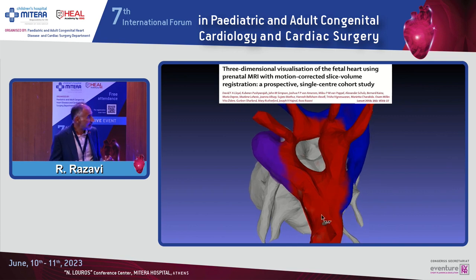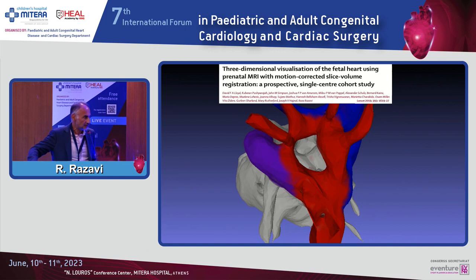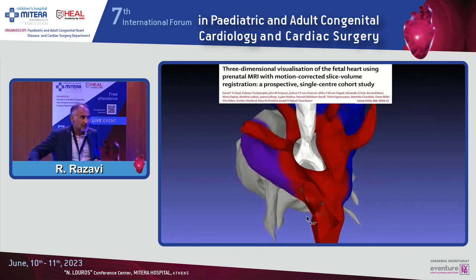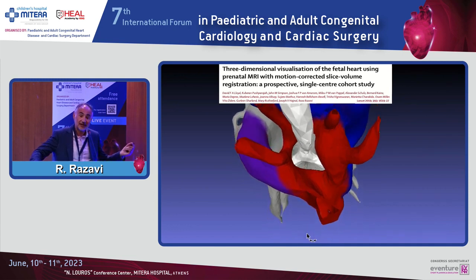And then we applied this clinically. This is our initial larger clinical result, published back in 2019. Here is the double aortic arch in a fetus, a tiny heart moving away, and you can properly see the anatomical structures of the vessels very nicely, things that can be hard to do on echo. So that's aortic arch abnormalities.